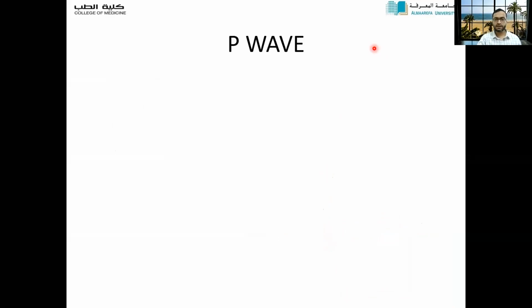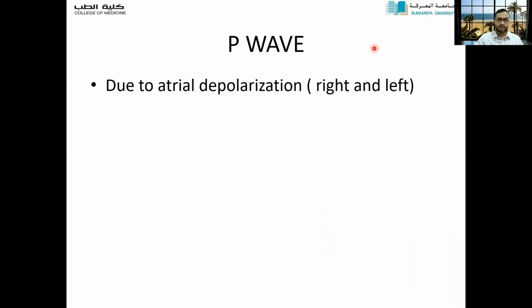Let's start the discussion. First I will describe individual waves and segments, then we will start reading the ECG. Analyzing the individual waves and segments is also important when we are proceeding towards analyzing the ECG.